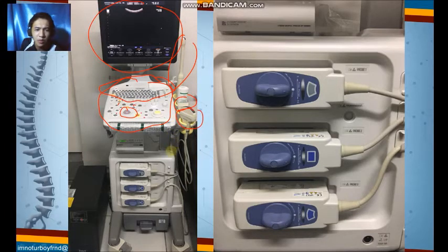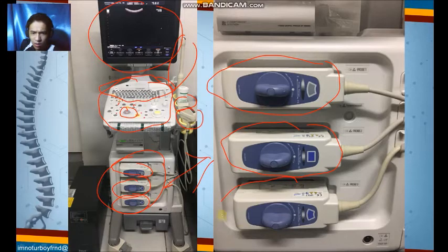And then we have one, two, and three transducers. Most commonly in the clinical setting, the number of transducers is 3. And then these transducers are connected to the hard drive, to the CPU of the ultrasound machine, and then this image is enlarged. Okay. So these are the connecting drives for the individual transducers.